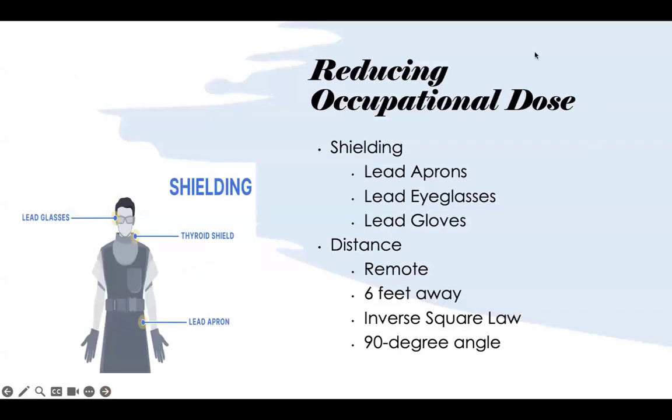All right. So reducing occupational exposure. Of course, we know we wear our lead aprons, lead eyeglasses, lead gloves, because sometimes when you do small bowel series, the doctor may have a lead glove and touch the patient's stomach to separate out their intestines. They also have a paddle, and it has a balloon in the middle. Sometimes they'll inflate that balloon, which has the same little ball on the end as you would have if you're inflating a blood pressure cuff. It has a little device you can turn to keep the air in, and turn to let the air out. They use the paddle sometimes.